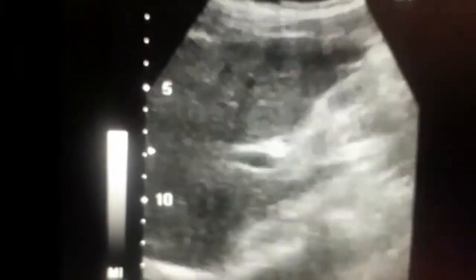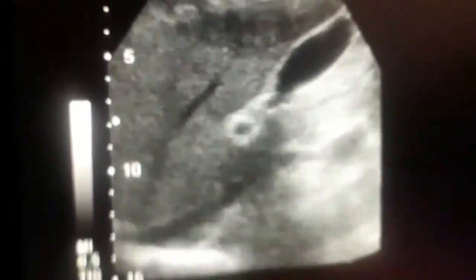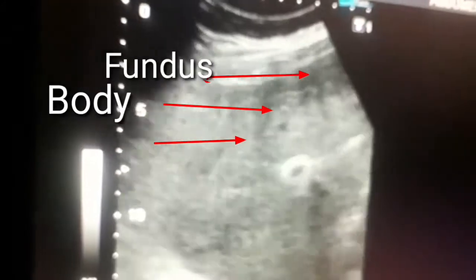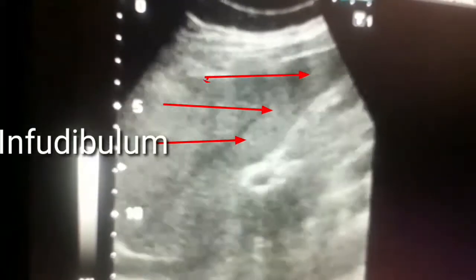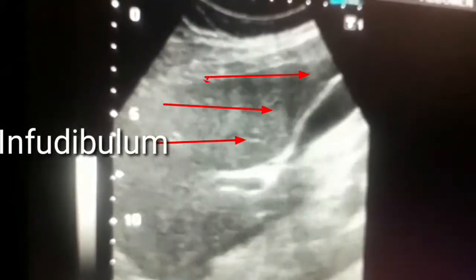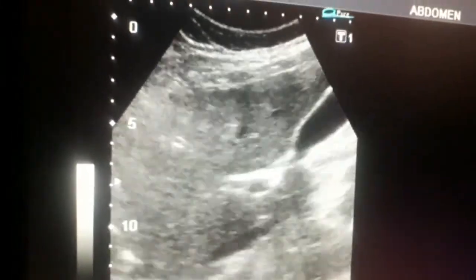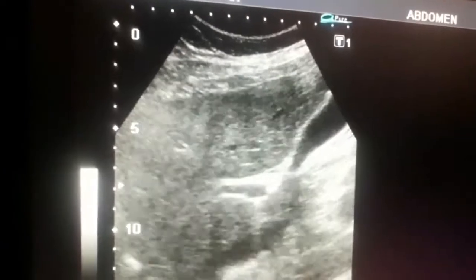In this ultrasound we will show you the normal liver, gallbladder, and kidney — that is the right kidney with a distended or dilated pelvis. You can see the liver echo texture appears to be normal.